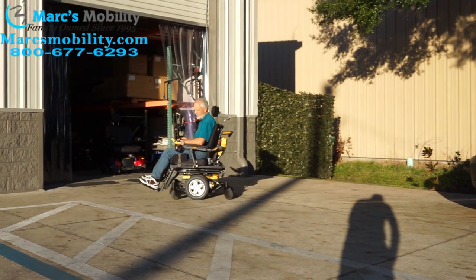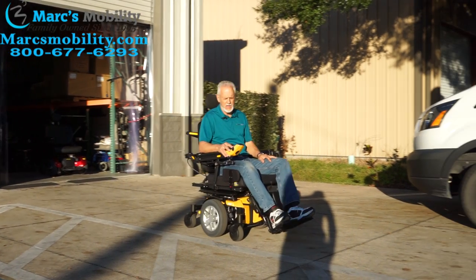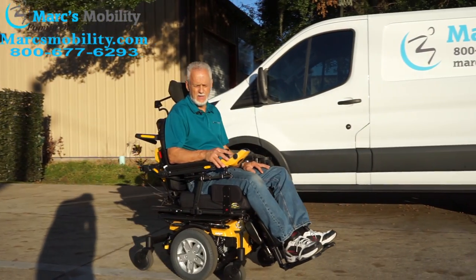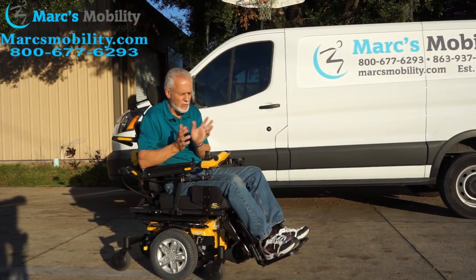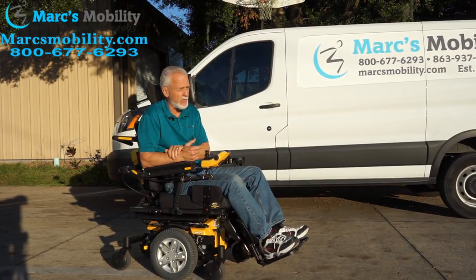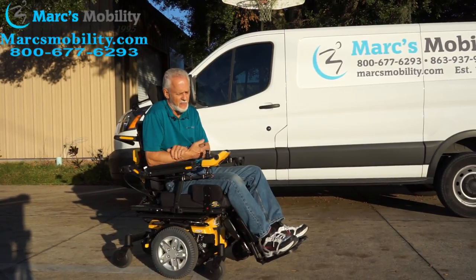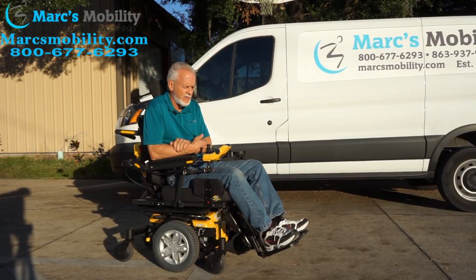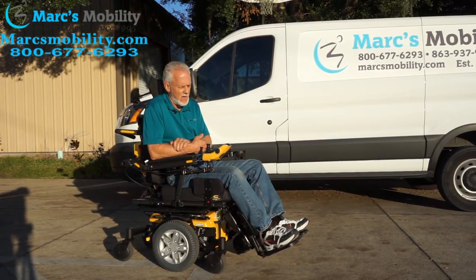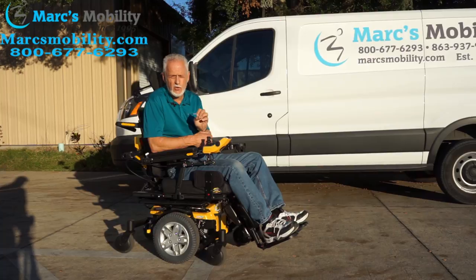Alright folks, this is the Quantum Edge HD — heavy duty, 400 pound weight capability. The top speed is 4.2 miles an hour, which is what I'm showing on the register here. Even if it's actually going 4.5, it's only registering 4.2. These chairs don't go very fast because the motors are HD — they're not high speed, they're high torque.